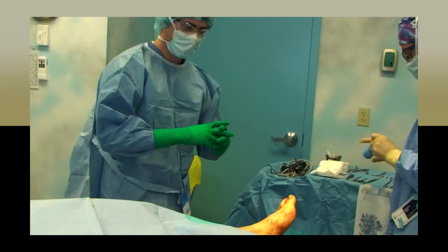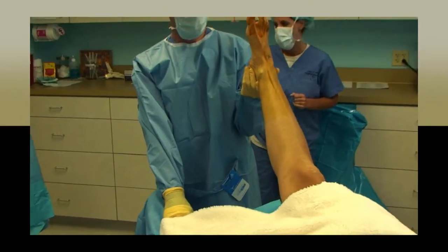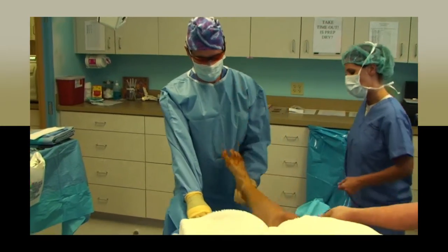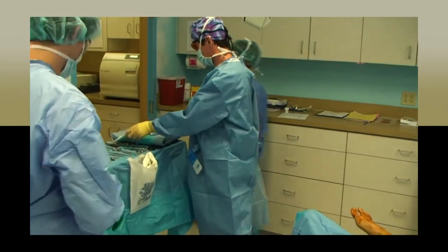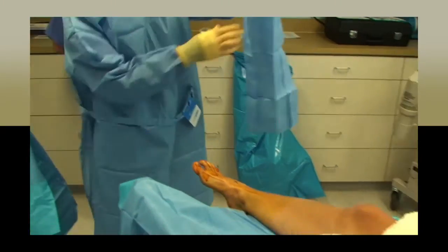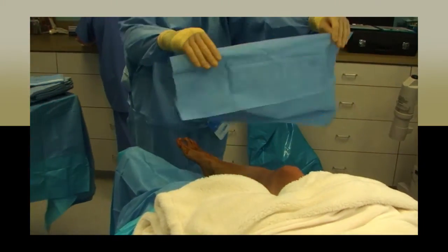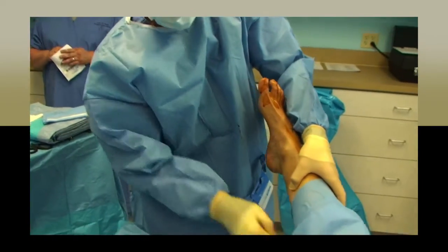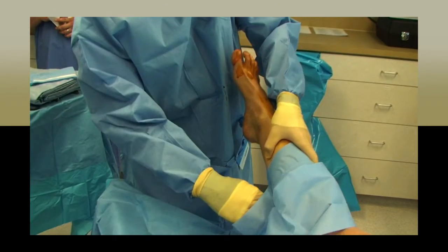When this is complete, you will need to prepare the sterile field around the prepped patient. After the surgical site has been prepped, you will take the plastic sterile sheet and place it under the leg, allowing the surgical assistant circulator to place the leg down on the table. You will then take an adhesive towel and pat dry the prep solution from the leg, making sure to check for any pooled solution. Place an adhesive towel around the top portion of the prep.